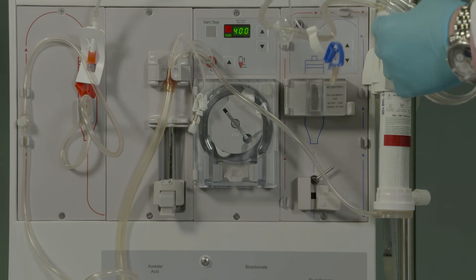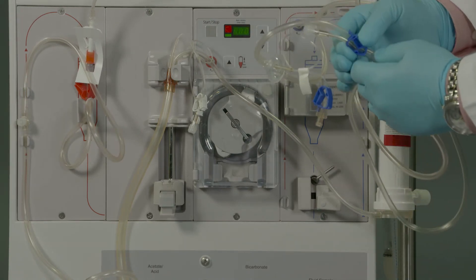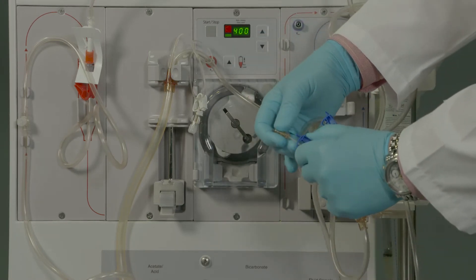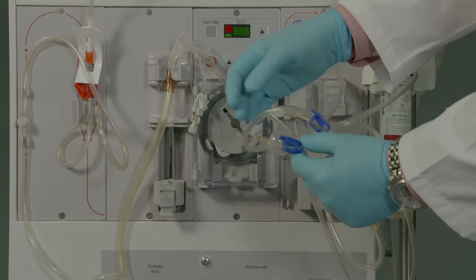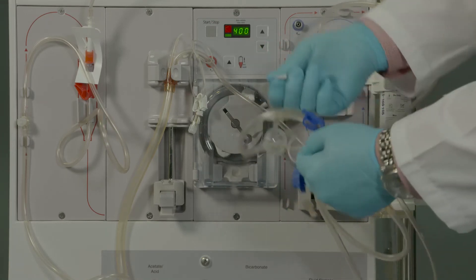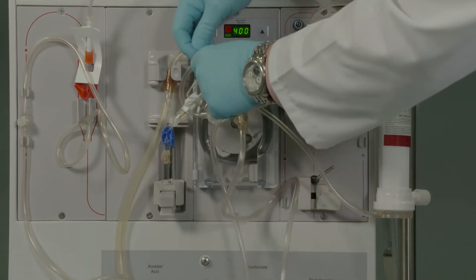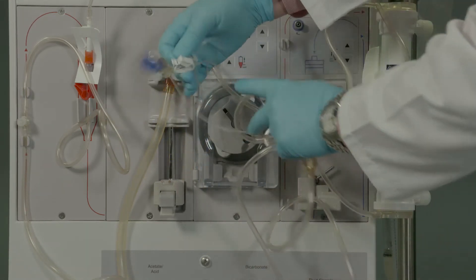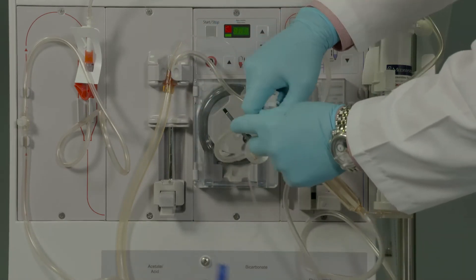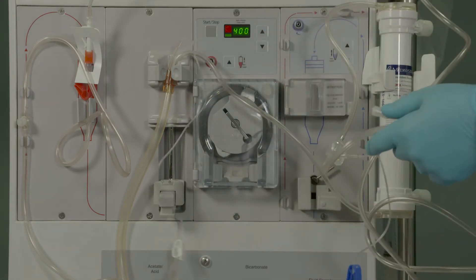Clamp the level adjust medication line, venous pod monitor line, and heparin line and remove the coiling tape from these lines. Remove the remaining white or blue coiling tape from the venous portion of the set.